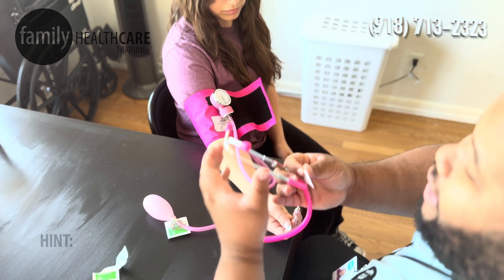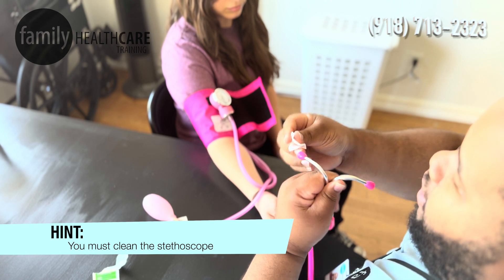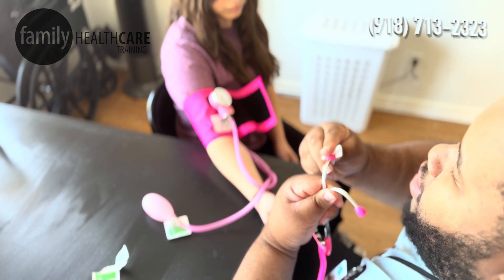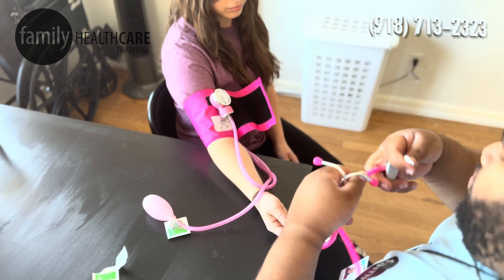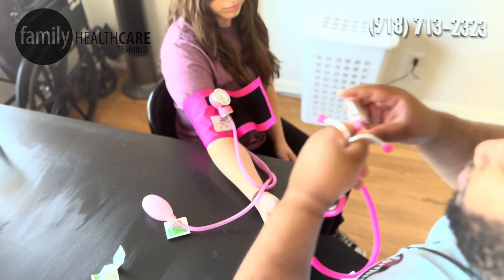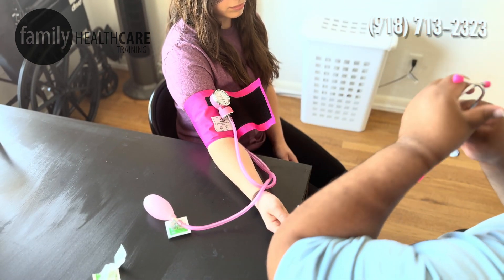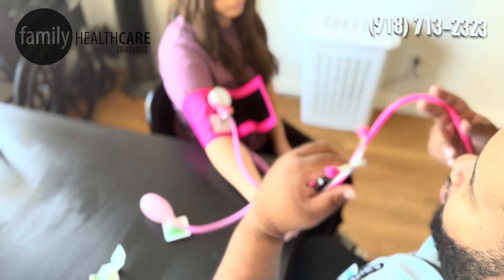I want to make sure that I clean my stethoscope — especially the part that's going to be going into my ears and the part that's going to be touching my patient. Make sure we let that air dry, because you probably don't want alcohol in your ears.